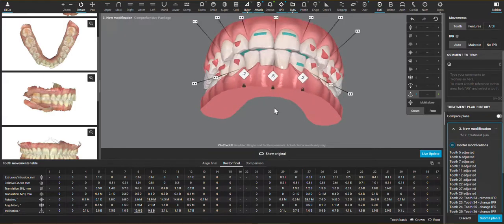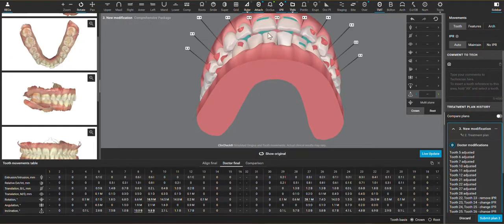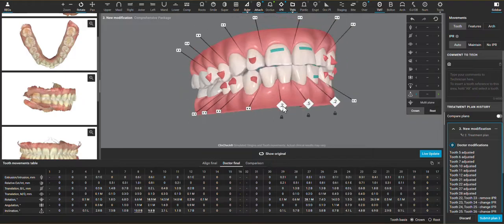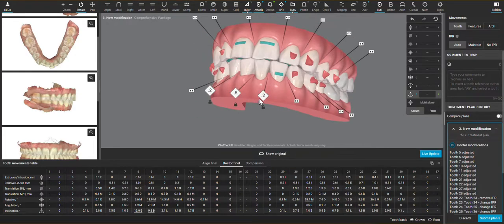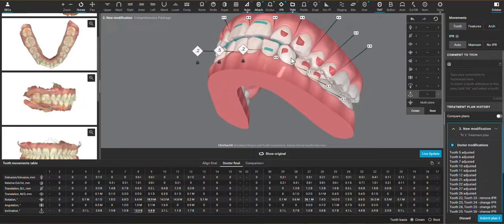Again, with any traumatic occlusion, I want to finish with inter occlusal space so that we don't fall short of the goal.